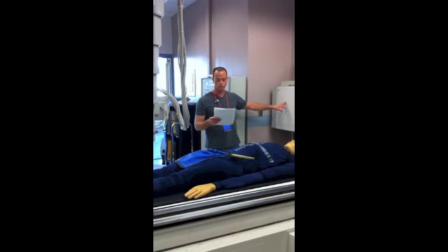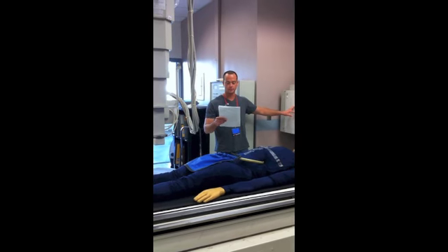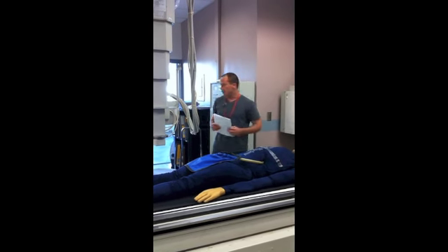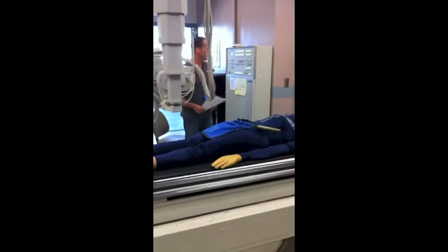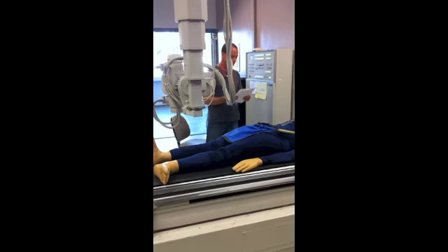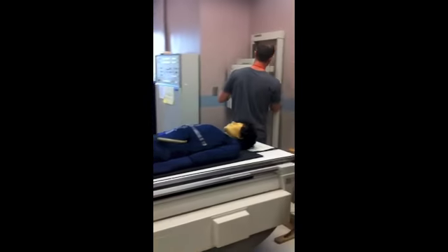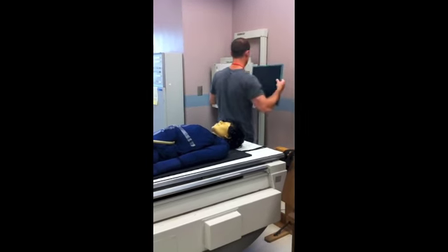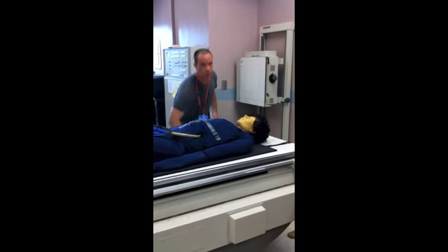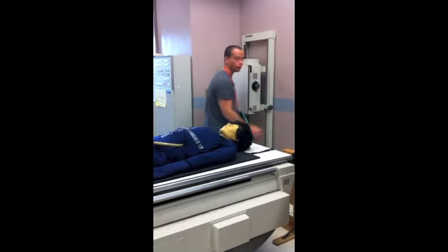Again, my technique is average size male adult, 110 and 8. So time to take the exposure. Sir, will you please take a deep breath in, hold it, don't move. Okay, we've just taken that. So I'll take the IR out of here, replace it with a fresh one. For the lateral chest, we'll be doing portrait.